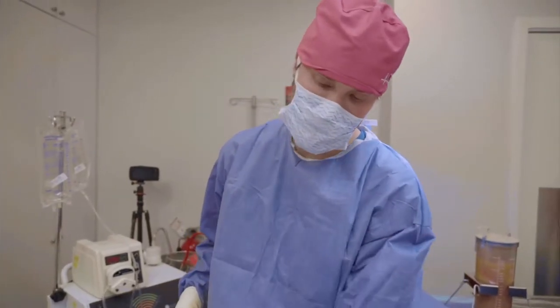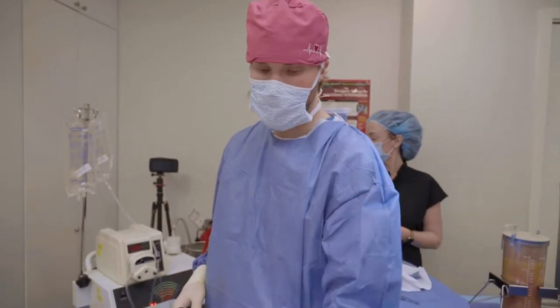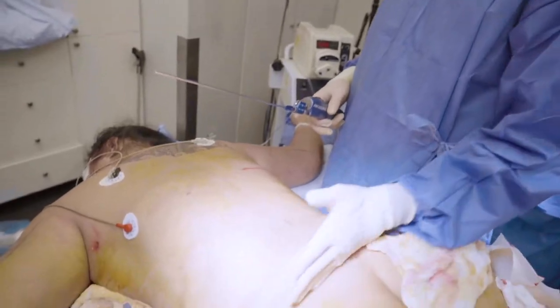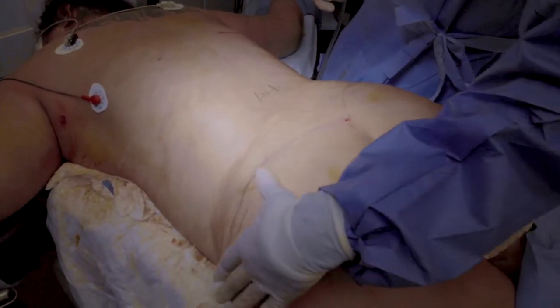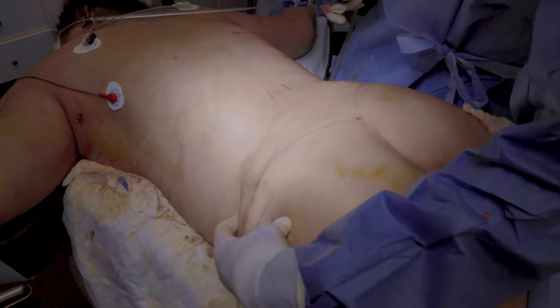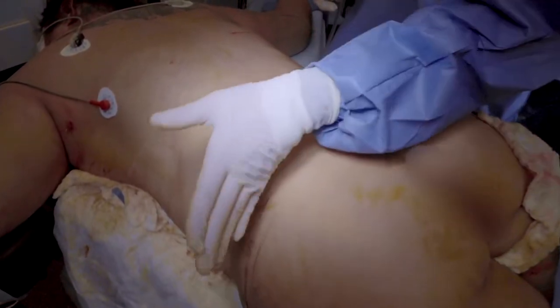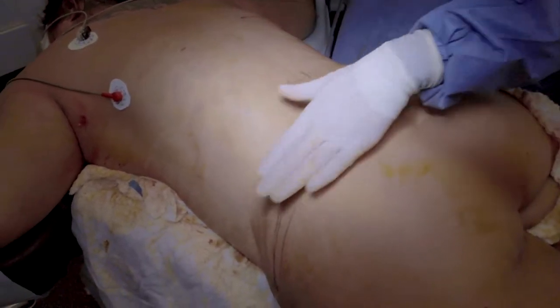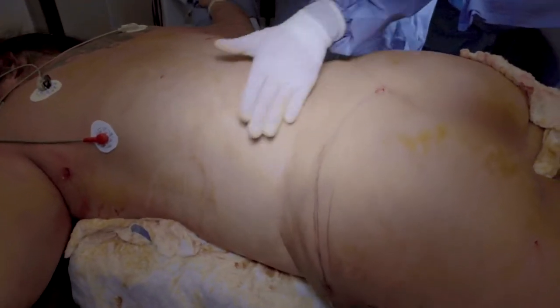The next step is to do liposuction of the back. This kind of defines the angle here. Once you suction the fat from on top of the butt, it shapes it to be an hourglass instead of rectangular — like this one, because there's a little extra fat on the sides on top. So once you get the love handles down, it becomes more of an hourglass shape. Now I'll take all this fat from here and go back.